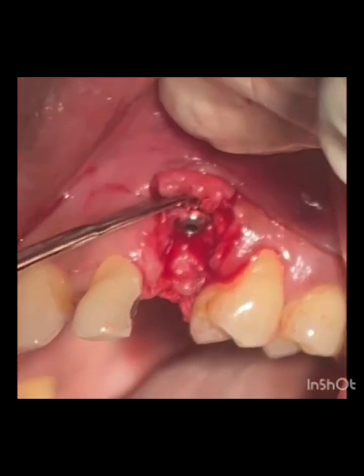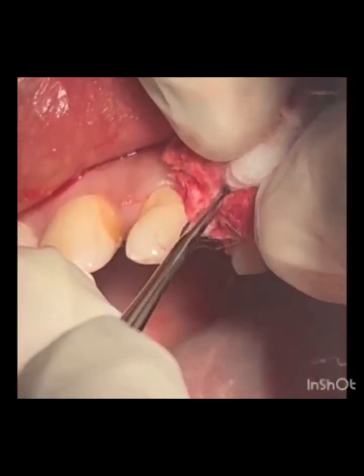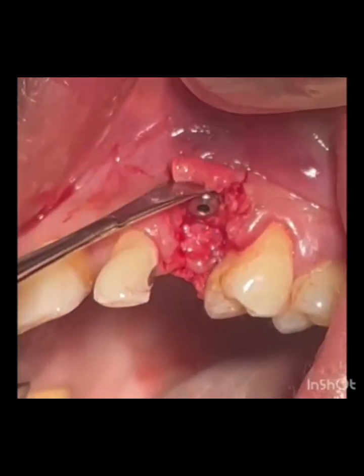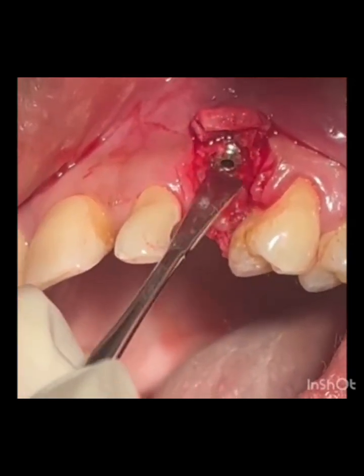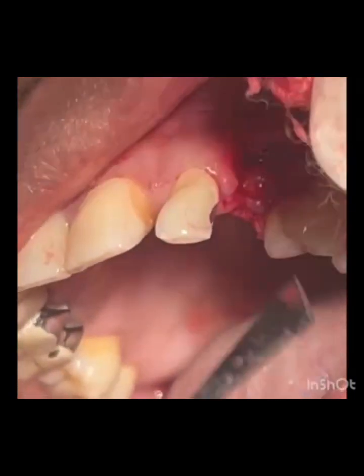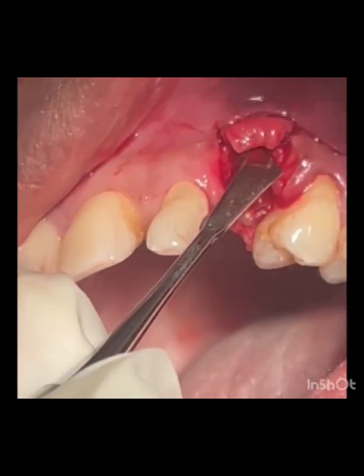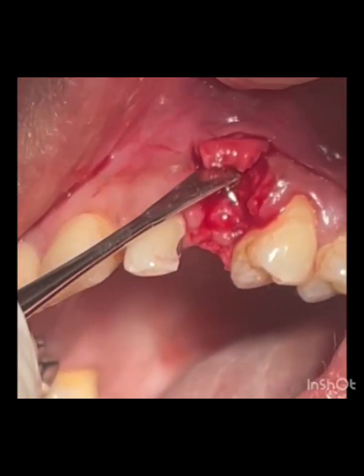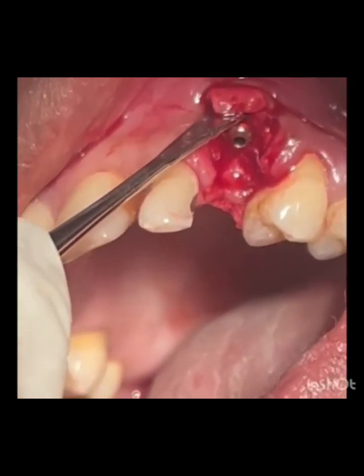As you can see here, the implant is being exposed. Positively, it had a lot of bone over it, but unfortunately not much on the labial side. On all the three aspects it has got bone, but not on the labial side. One reason could be that it's an immediate implant, and for some reason it never had much buccal bone. So now this is the tissue that has been raised on the buccal side.